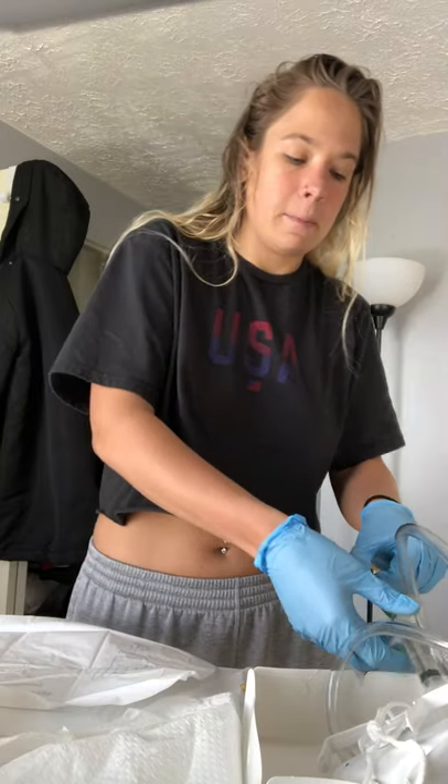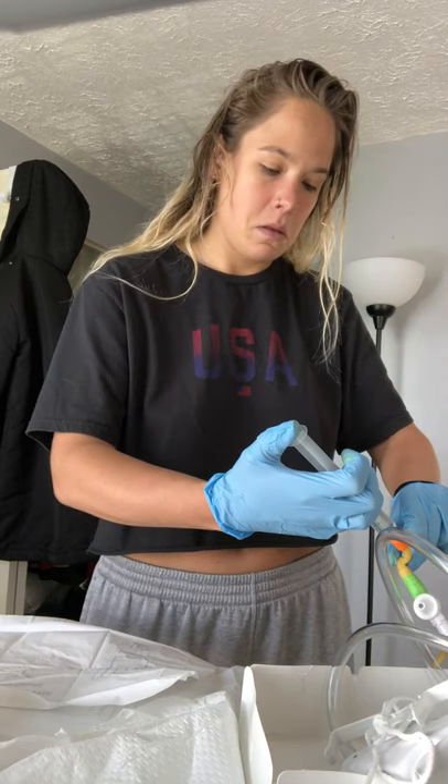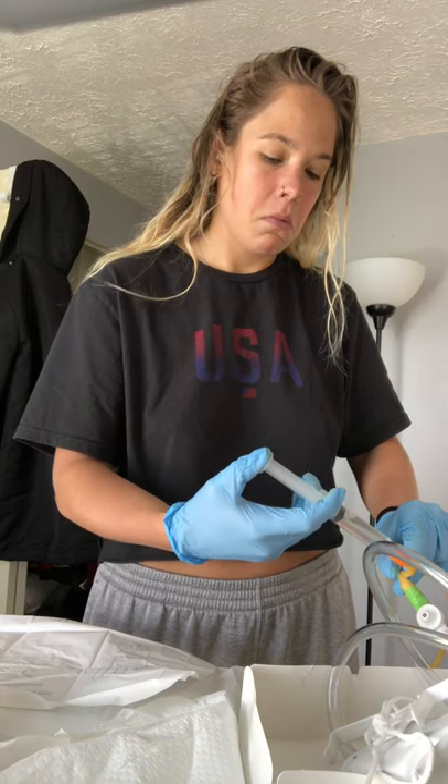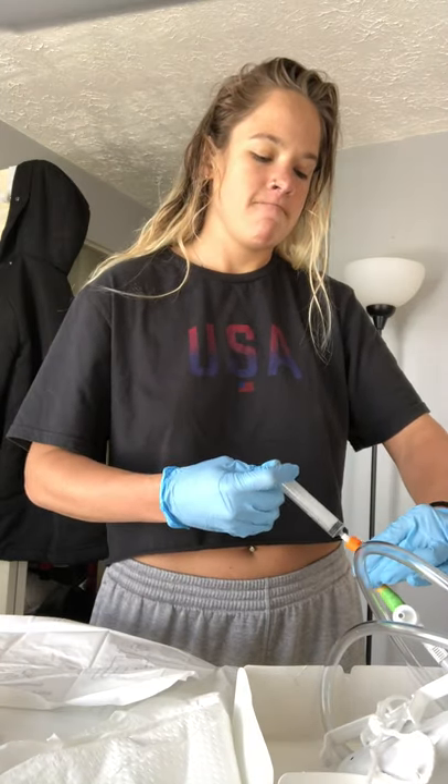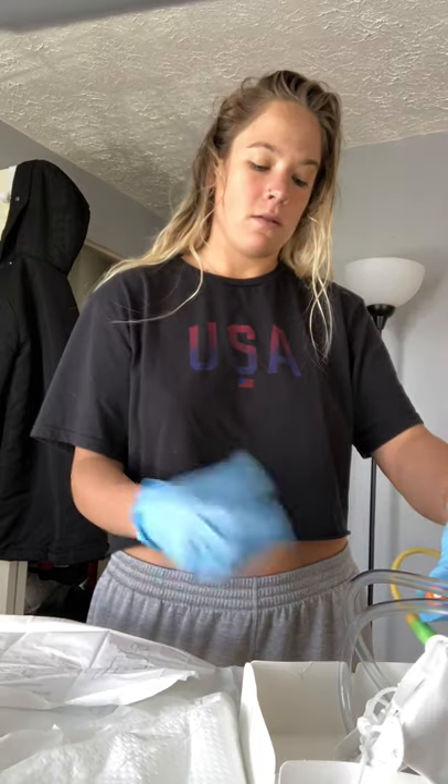With my dominant hand, I'm going to go ahead and fill up the balloon. I'm going to leave my finger on the plunger and disconnect the plunger, putting it in the trash. Then I'm going to pull back on the catheter until I feel some resistance, knowing that the catheter is in place.